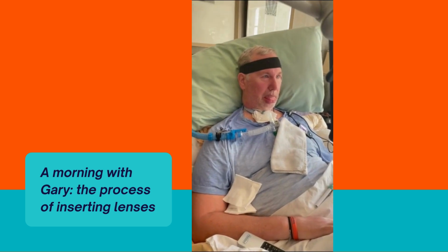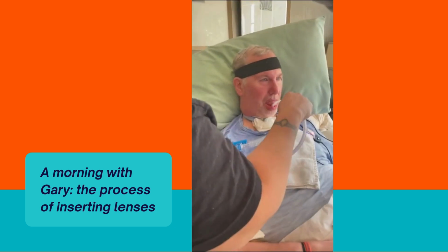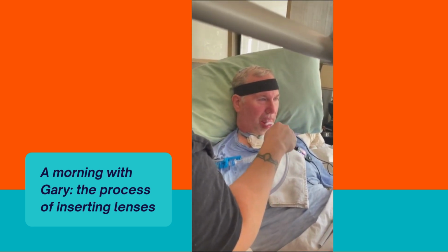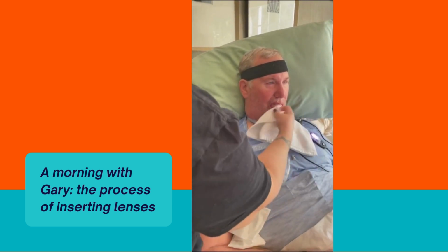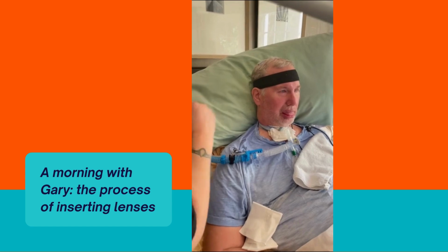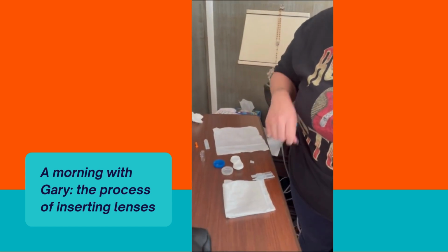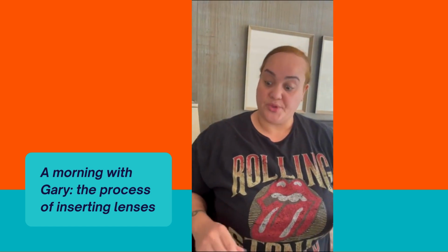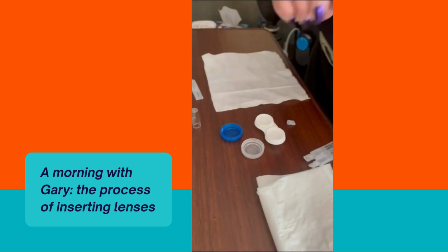Okay, that takes a little bit to get. Don't think it's going to happen for you the first time like that. Definitely not. The left eye is the hardest eye, the one where you have to reach over the nose. If you're left-handed, it would be the right eye. It's especially hard if your hands are a little shaky, so make sure you have your arms stabilized so you can move more controlled with your hands. Because my biggest fear with Gary is I'm going to poke his eyes out.